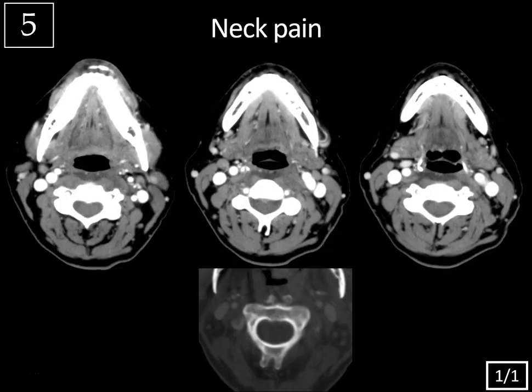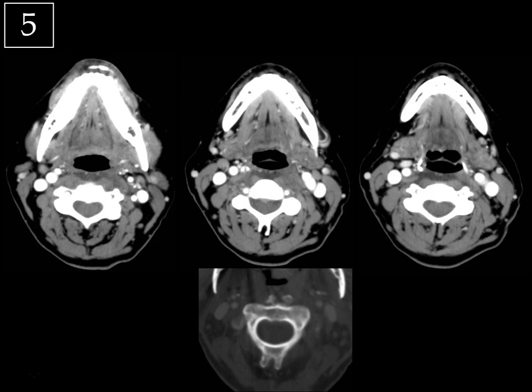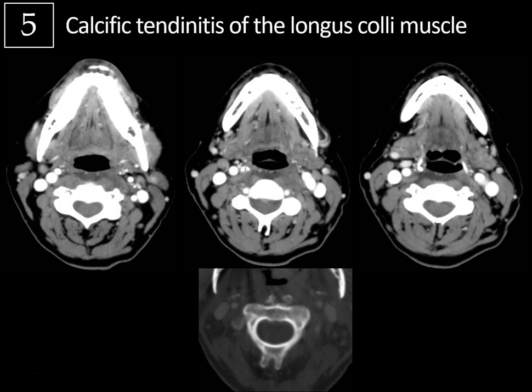All right, last case — CT neck, history of neck pain. We're looking at three contrast-enhanced images of the neck. We are at the floor of the mouth, but there's nothing going on there in this case. Just to quickly review the muscle anatomy: here's the mylohyoid muscle, hyoglossus, and genioglossus. But notice how we've got this fluid here — what space is that in? That's in the retropharyngeal space, located posterior to the pharyngeal mucosal space and anterior to the prevertebral space, anterior to the longus coli muscles. So we've got a retropharyngeal effusion. Is this an abscess? Well, you don't really see any rim enhancement there. And there's another clue on the lower CT image: there's a calcification anterior to the C1-C2 level in the region of the superior tendons of the longus coli. This is typical for calcific tendinitis of the longus coli muscle.